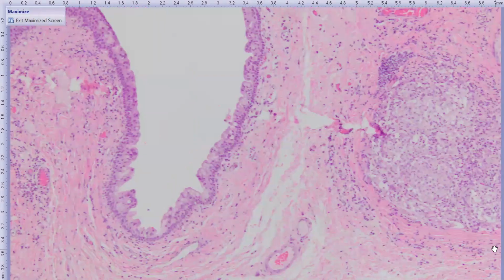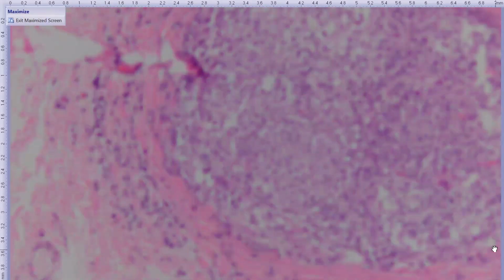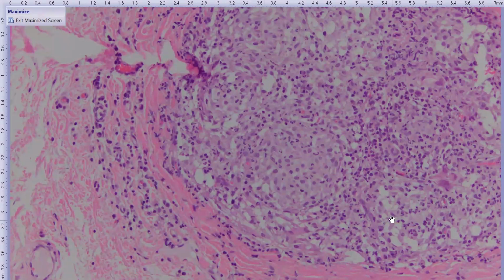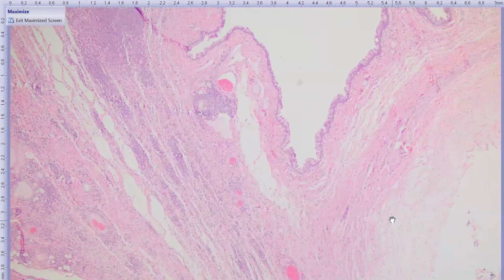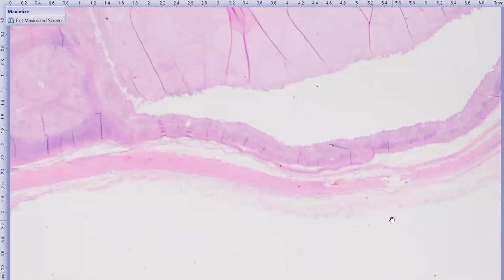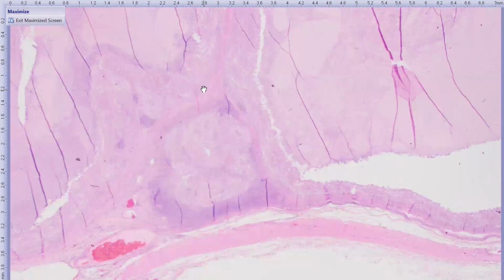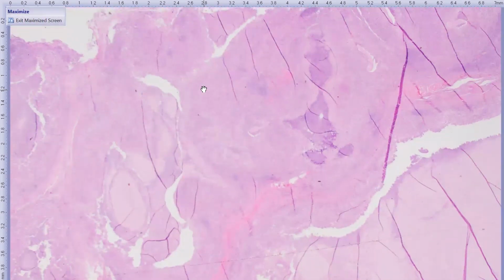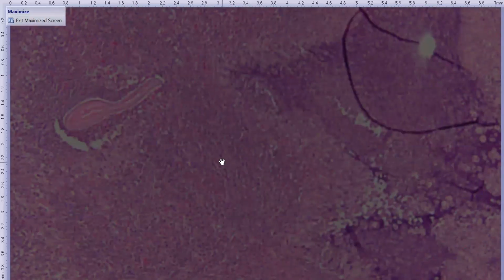We have at least one little pocket of inflammation here, composed of epithelioid macrophages and some neutrophils. But let's keep going back for the bigger part of this mass. So let's go back to lower mag. So once again, we actually have rims of inflammation that are more solid, surrounding these pockets of more liquefied material. And so I looked at this and thought, okay, so what is causing this? But anyway, we're going to start right over here. And so these are inflammatory nodules.